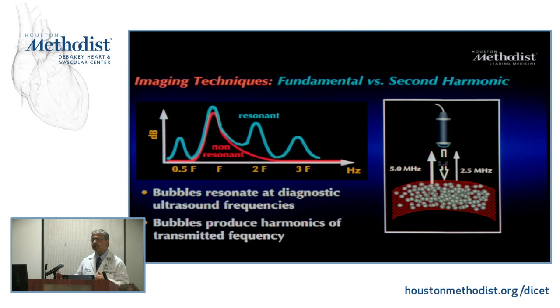The interesting thing is that this is not what you plan, but what you get is that we never thought, at least the inventors never thought, that the heart would also emit harmonics, okay? So it's not only contrast, it's also the heart that emits harmonics. So nowadays, most of the sonographers use harmonic to image even regular stuff.